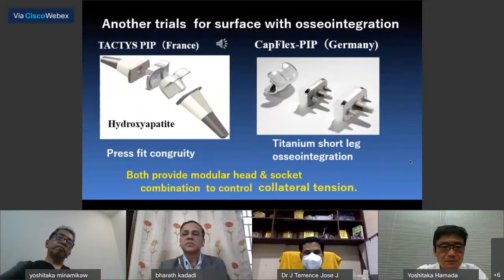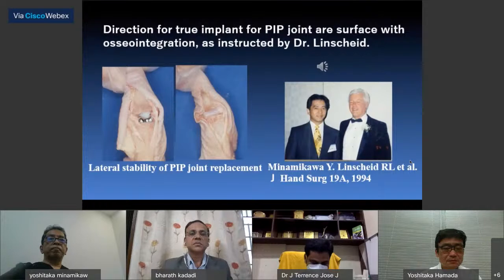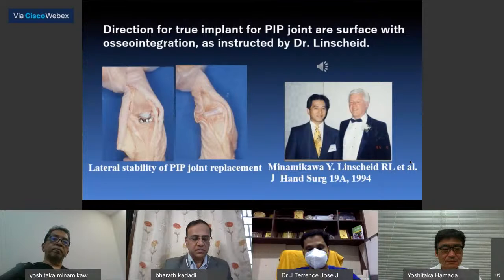Tactys PIP from France has a hydroxyapatite stem with press fit congruity. Capflex PIP from Germany has a titanium short stem with osseointegration. Both provide modular head and socket combinations to control collateral tension. In conclusion, other than silicone, the direction for a true implant for the PIP joint is surface replacement with osseointegration, as instructed by Dr. Linscheid.